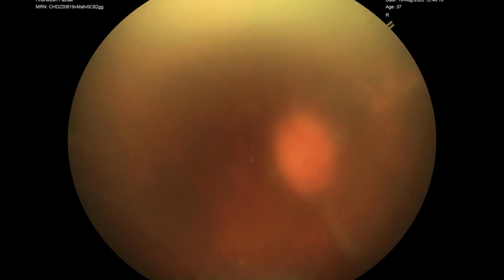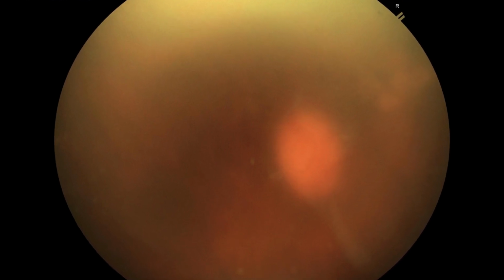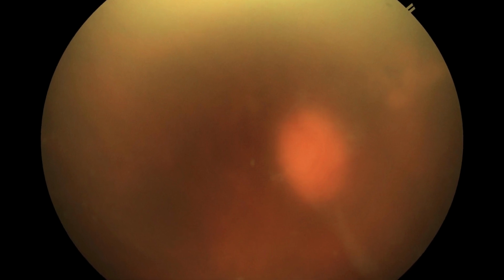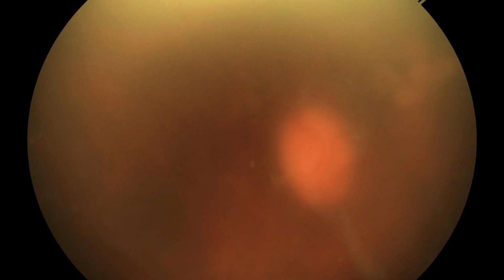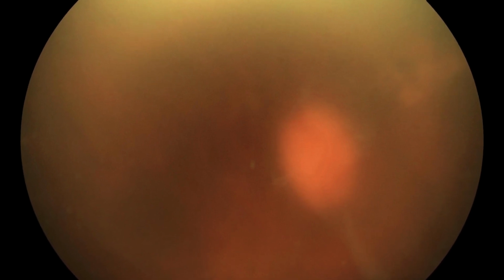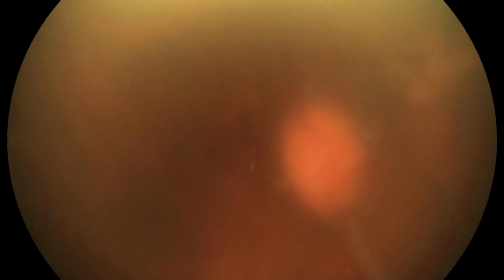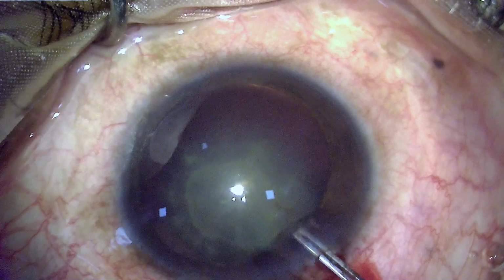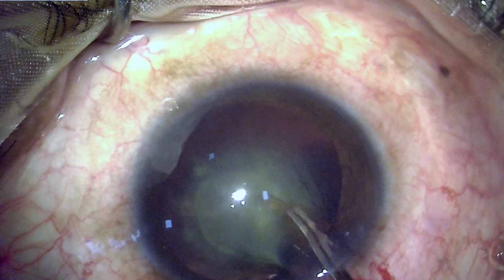This is the fundus photograph, and this patient had a detachment in the past for which two surgeries have been done. The buckle surgery was unsuccessful, so silicone oil was instilled and now the retina is on, and the patient at the end of the surgery had recovered to a vision of 6/24. The patient was highly myopic. So a corneal incision has been made and now we are performing anterior capsulotomy.